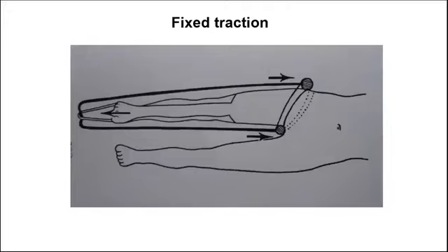This is a fixed skin traction, very good for transport or temporary immobilization of femur shaft to knee, or even tibia fractures while awaiting definitive treatment or transporting from one facility to another.